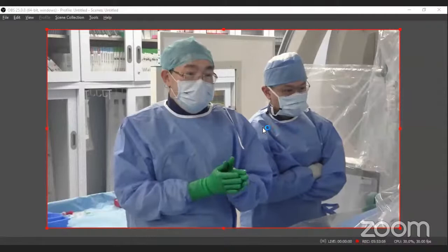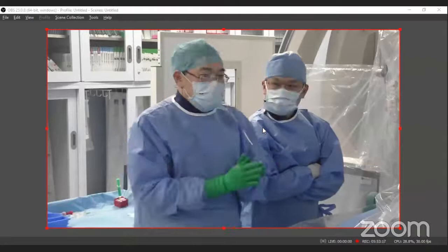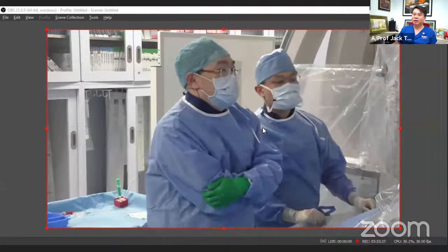So for Culotte, if you have both side branches which are very critically narrow, then you have to be pretty careful because you may lose one of the branches. Yeah, great point. So you have to pull the wire back. You have to change out the wire again for Culotte. So yeah. Maybe Chiang, also for you, what is a learning point you want the fellows to bring home?